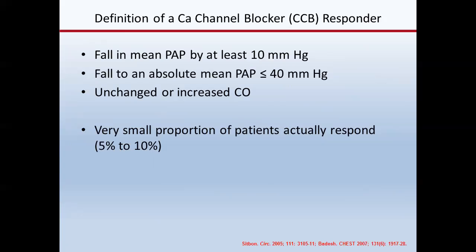How do I know that? This is also data from a French group who collected data and did nitric oxide testing on every patient they saw for 15 years.